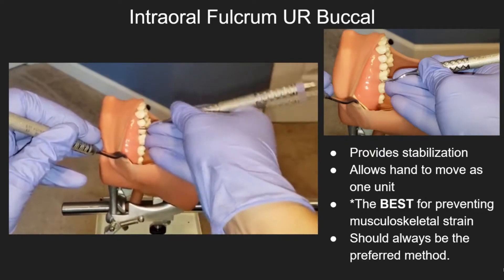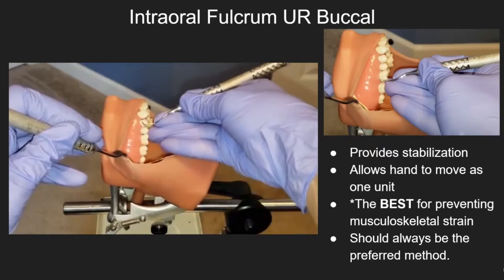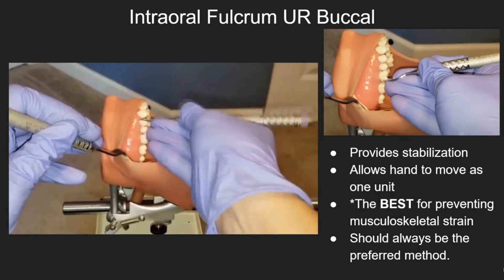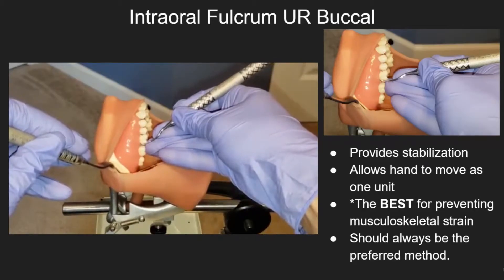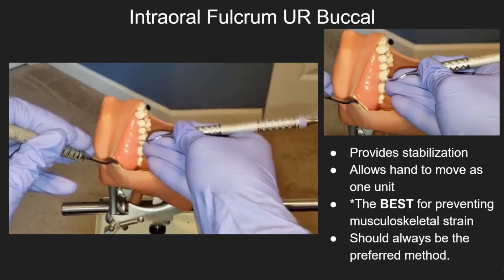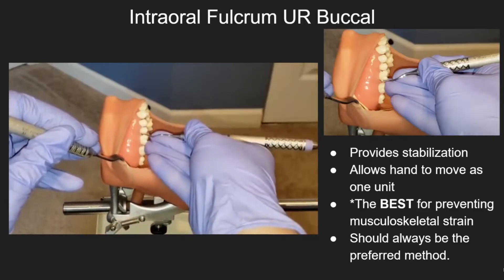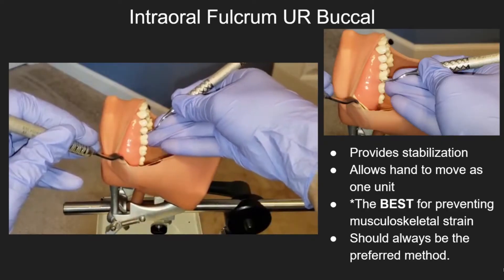Always when using an intraoral fulcrum, make sure that you are fulcruming one to four teeth away from the tooth you are instrumenting. Remember, things get slippery inside the oral cavity when there is saliva on the surfaces of the teeth, so make sure that you are fulcruming on the incisal edge, occlusal, occlusal lingual, or occlusal facial line angles of a tooth.